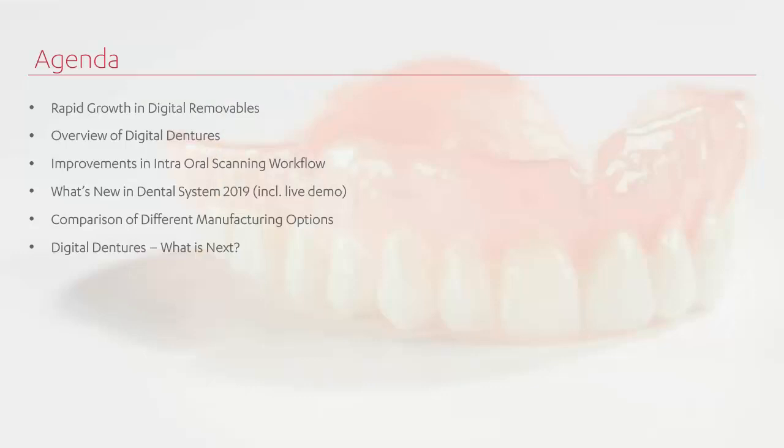So let's get started here. That's the agenda for today. Some short introductions. Then we look at Intra Oral Scanning. We look at the digital opportunities, the digital design service, and a particular dental system 2019, including a live demo. And we get an overview comparing the different manufacturing options. And then we look a little bit at what goes on in the future.